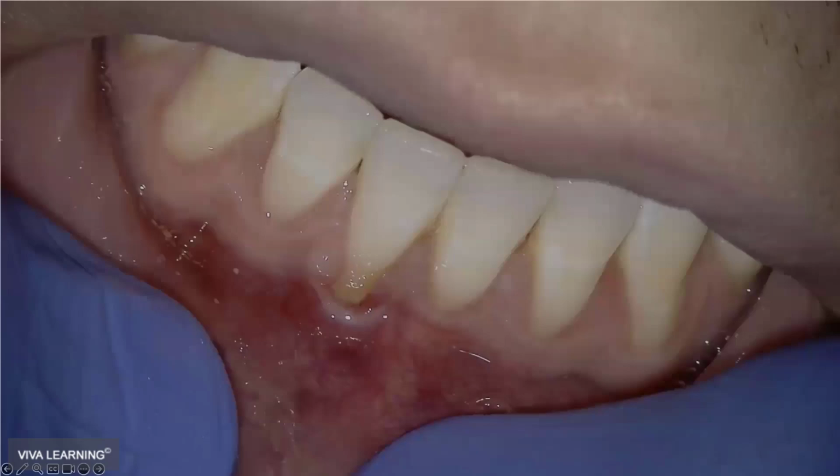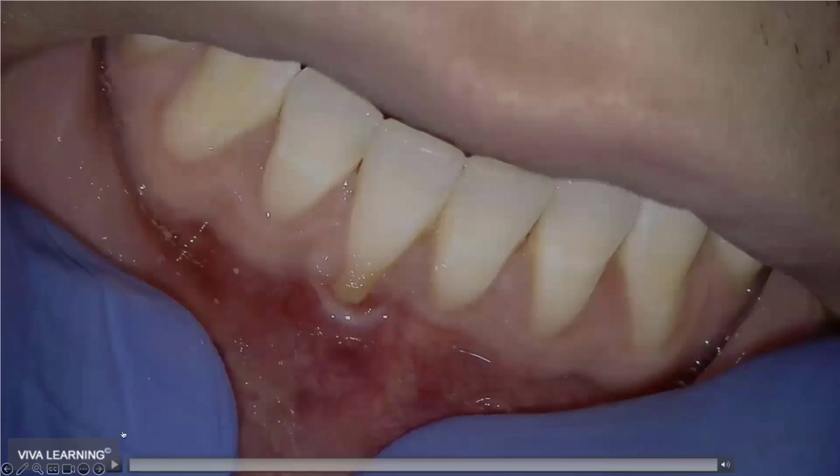Okay, so here's that vestibuloplasty I was talking about. The reason why we're doing this is, it's hard to tell from the video just from the angle, but right across here, this is the base of his vestibule. Like over here where you store your gum, there's a little pocket, a little vestibule by the cheek. There's nothing, right? And right here, you see where there's actually a tissue attachment that's causing recession here.